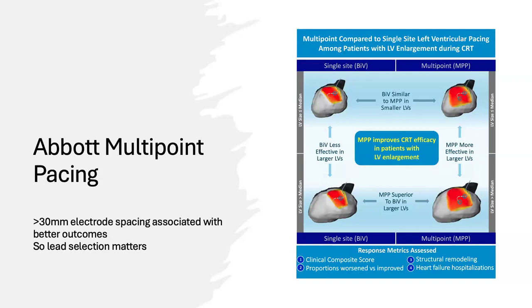as a non-responder option. So it may not be your first option for patients where you don't know if they're going to get another device, or you're worried about the total battery longevity. But if money and time is not an issue, then you can obviously consider that as a first option as well.